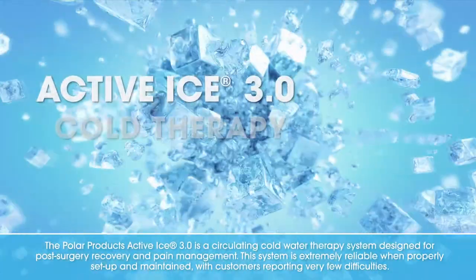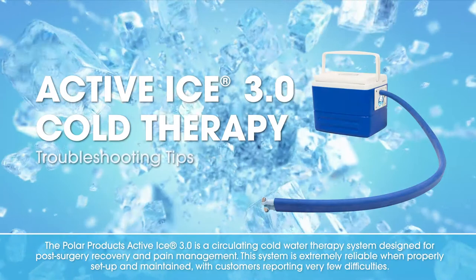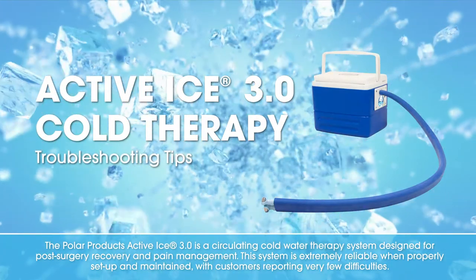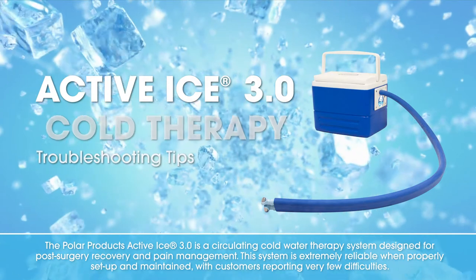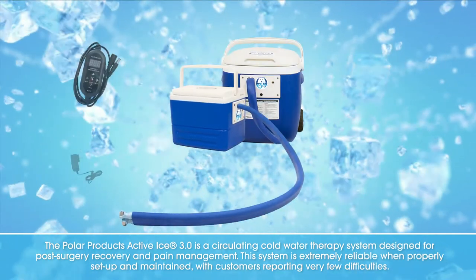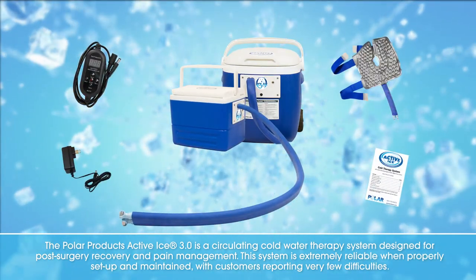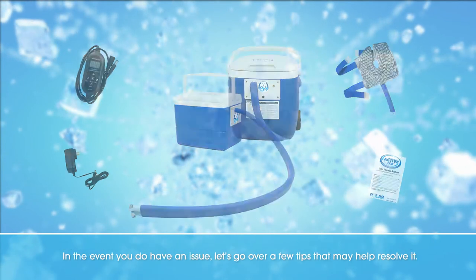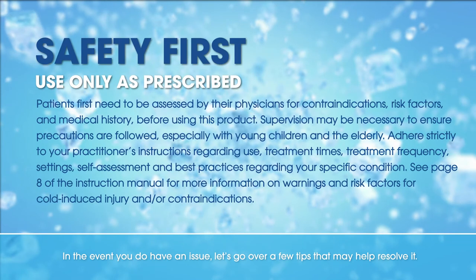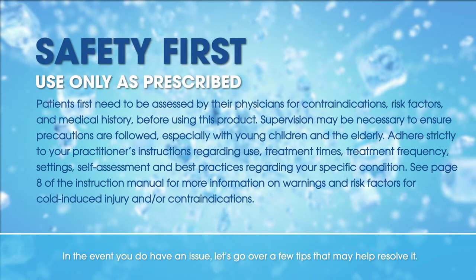The Polar Products Active Ice 3.0 is a circulating cold water therapy system designed for post-surgery recovery and pain management. This system is extremely reliable when properly set up and maintained, with customers reporting very few difficulties. In the event you do have an issue, let's go over a few tips that may help resolve it.